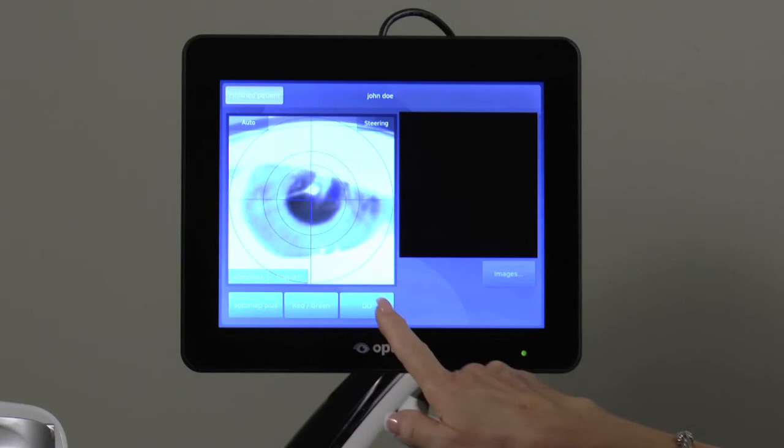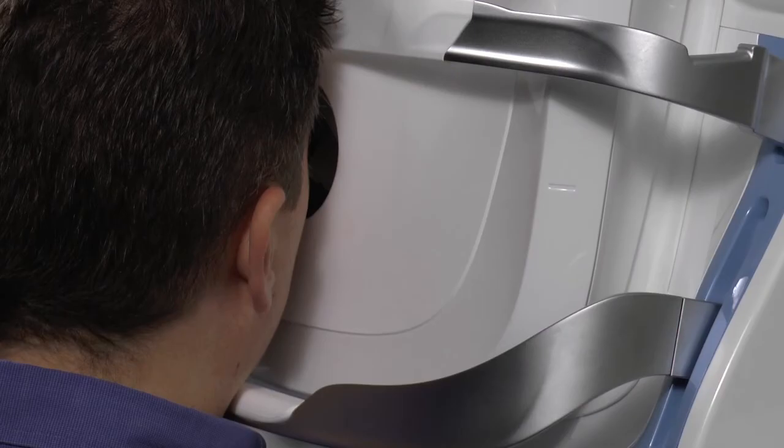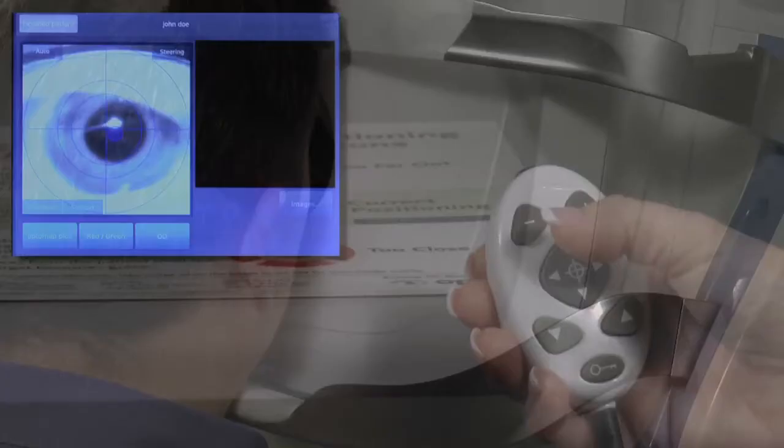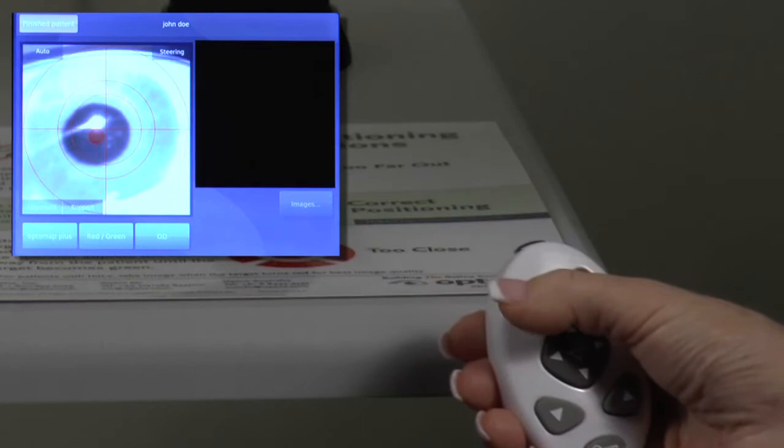Fine-tune patient alignment with the hand controller, which can be used to move the device back and forth on the x-axis, up and down on the y-axis, and in and out on the z-axis.